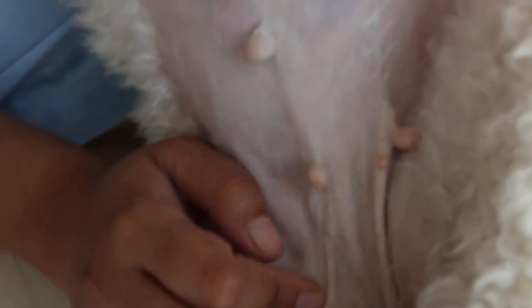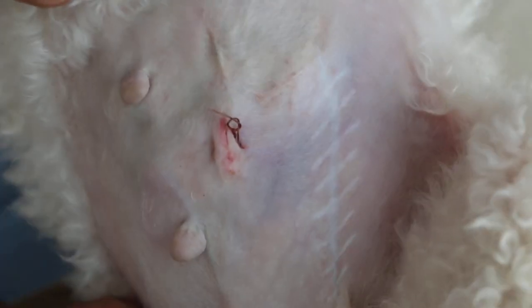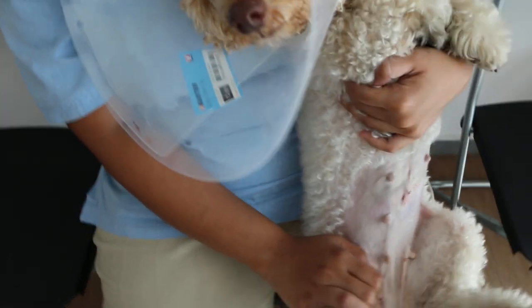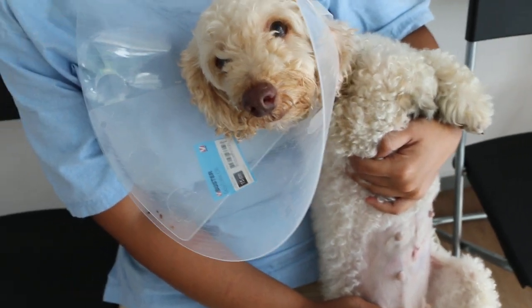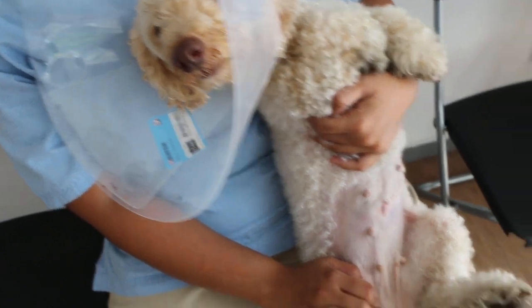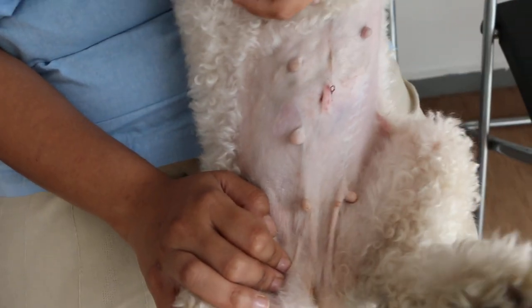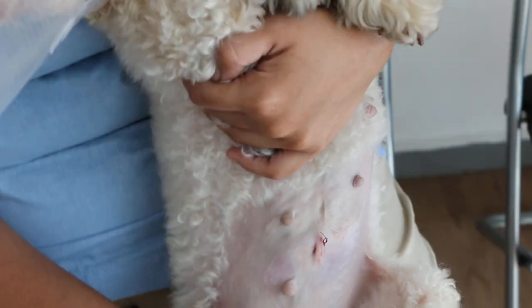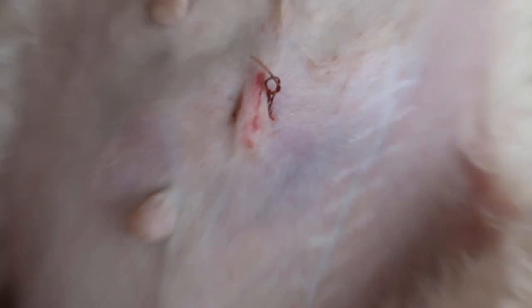There's another method where you put a subcuticular — under the skin — subcuticular suture; some vets prefer that. You can see the long scar here is due to a mammary gland tumor. Overall the dog is eating well. Is she going home today? How old is the dog? Five years old. There's a bit of swelling here, probably from the dog rubbing at the spay wound. The dog is given painkillers and antibiotics and goes home today — day three. You can see the wound looks good: no infection, no swelling, no redness at the operation site.